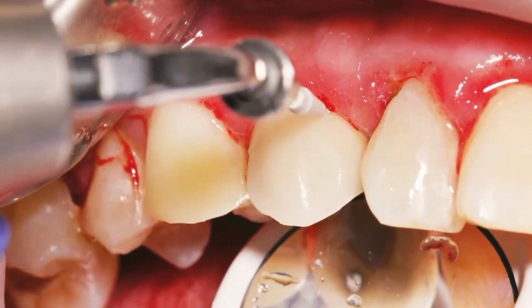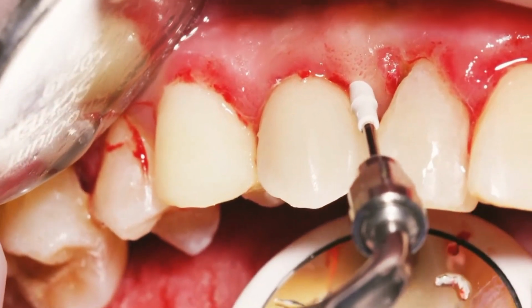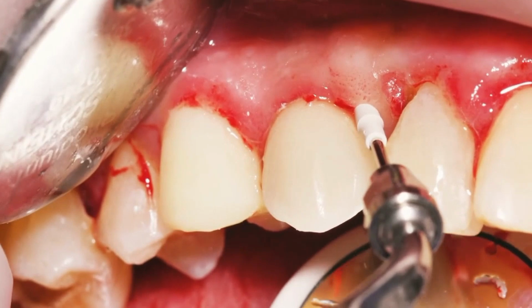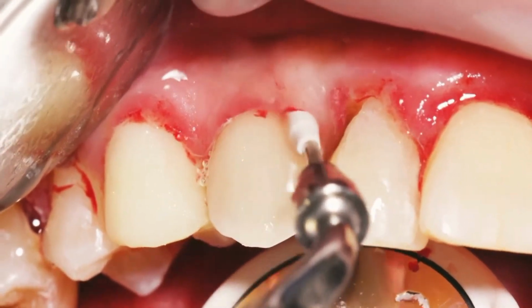In this part of the video, you can see also how we use the PI tip in the mucositis treatment.